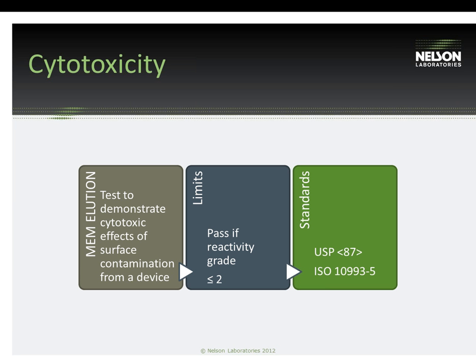Also, a lot of people will argue that they already had to do cytotoxicity as part of their more comprehensive biocompatibility test plan on their device. And that's fine. There's definitely no requirement that this test has to be done. It's just our recommendation to help justify that residue value by including it as part of the cleaning validation.